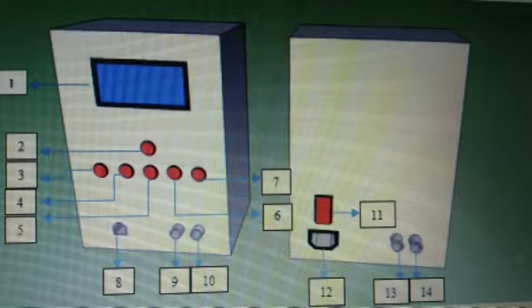The first thing to do is to make a 2-channel Infusion device analyzer design, where the device is used to calibrate the infuse pump or syringe pump. After the device can be used, the photodiode sensor study is conducted.